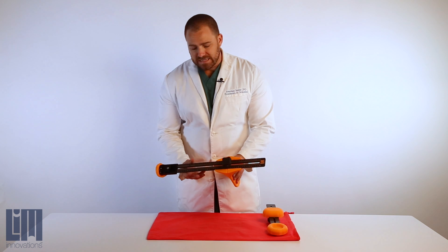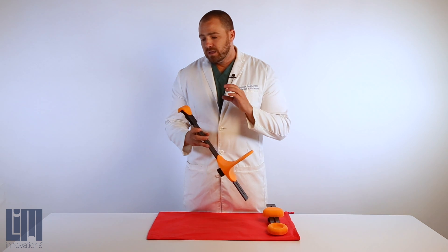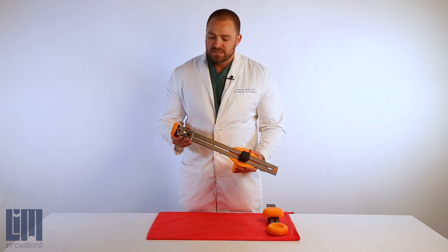The limb capture tools have been designed to make standardization of the impressions and the measurements that we take with the infinite socket really simple. There are two pieces that we'll explain here.